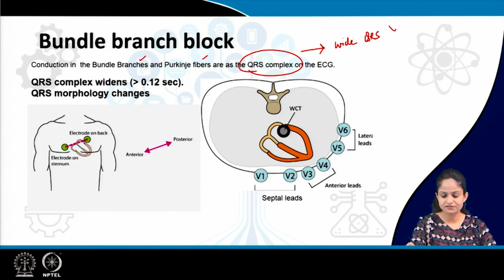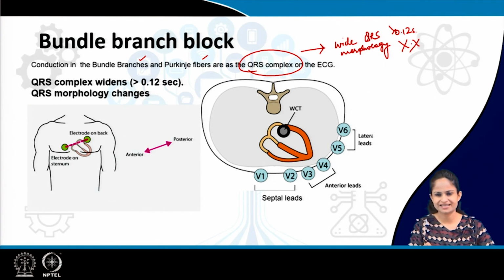The QRS complexes will be more than 0.12 seconds, and of course, the morphology of the QRS complexes will change. There will be bizarre morphology of the QRS complexes.